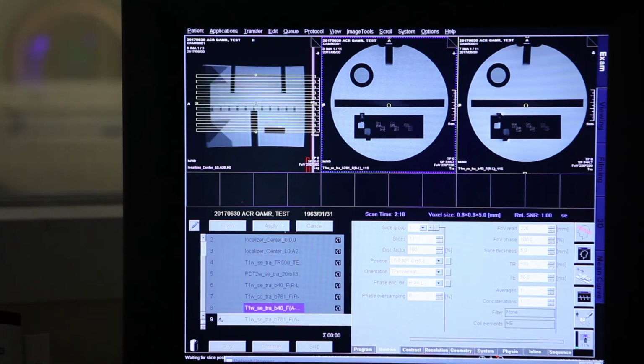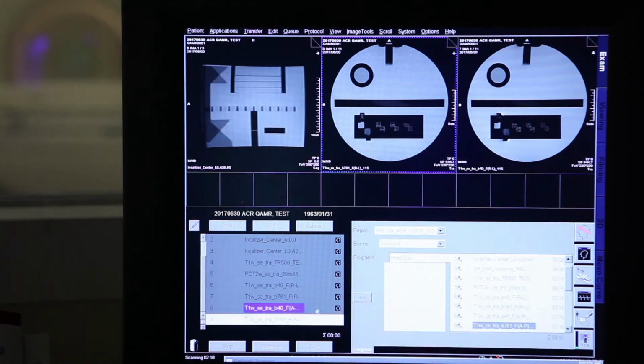Now let's see something amazing here. Remember, you have the shift in this direction, fat and water, right to left. Now the axis should be in the other direction, so I'm expecting to have the shift in the AP direction. And this is the ingenious design.